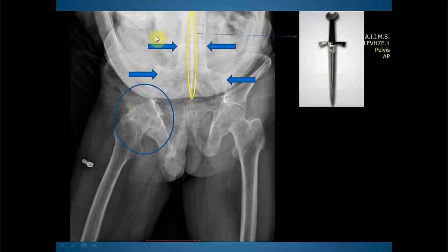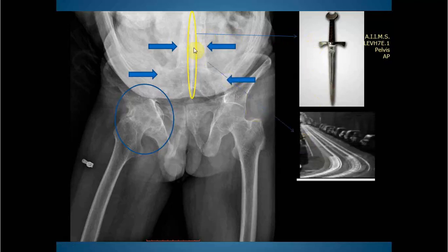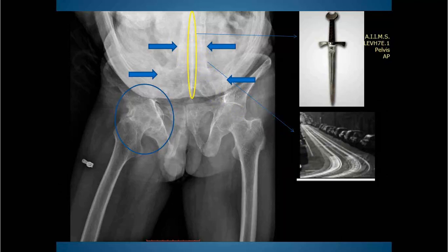The ossification of the interspinous and supraspinous ligament gives an appearance of the dagger sign. The two lateral lines and the middle interspinous line — these three lines give an appearance of the trolley track sign. This is a case of ankylosing spondylitis having multiple changes in the bones and joints.